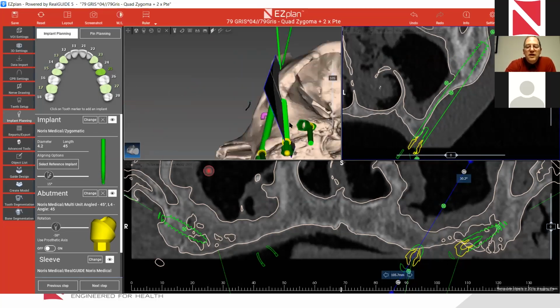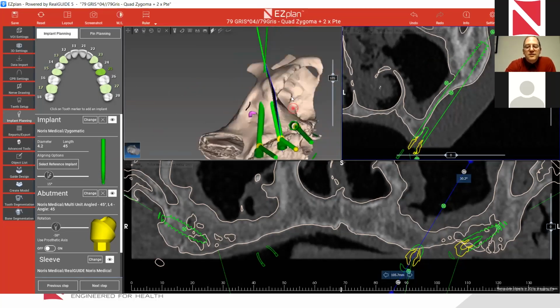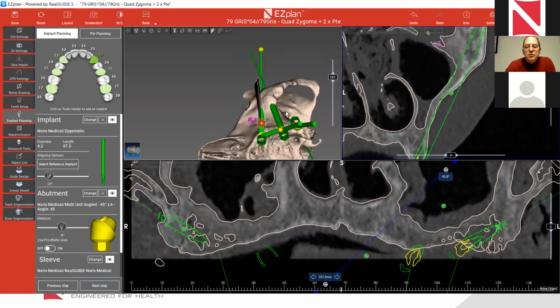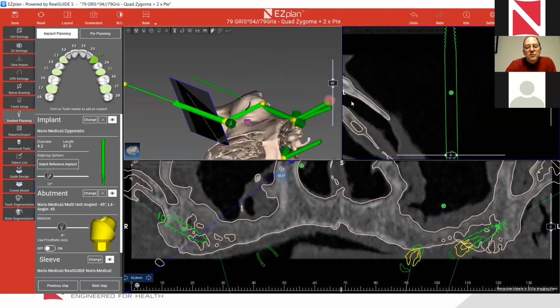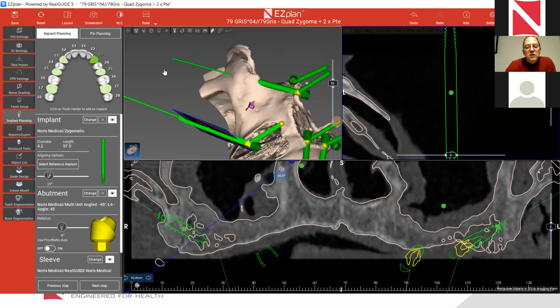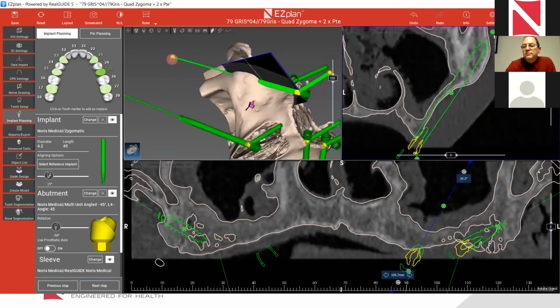But anyway, if we, for instance, did not have the anterior implant, and we started with the posterior one, and when we do the posterior one, we thought the best would be to put it this way. Yeah, we put it this way.